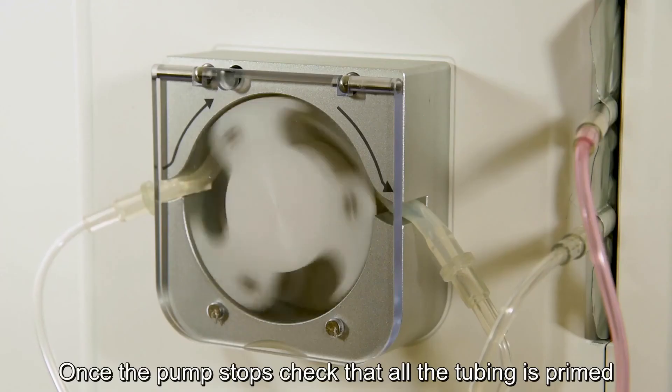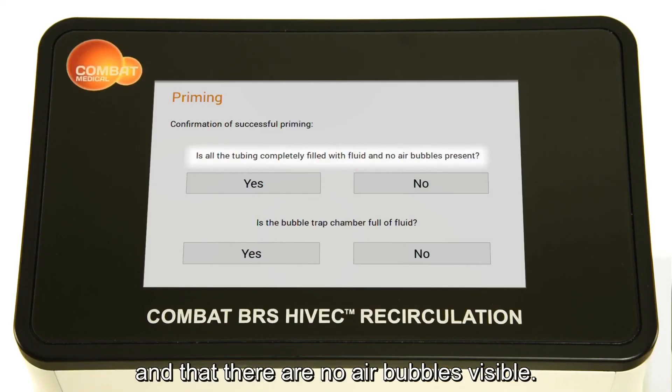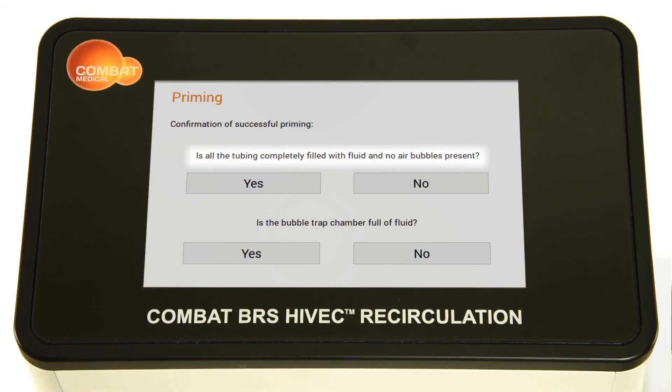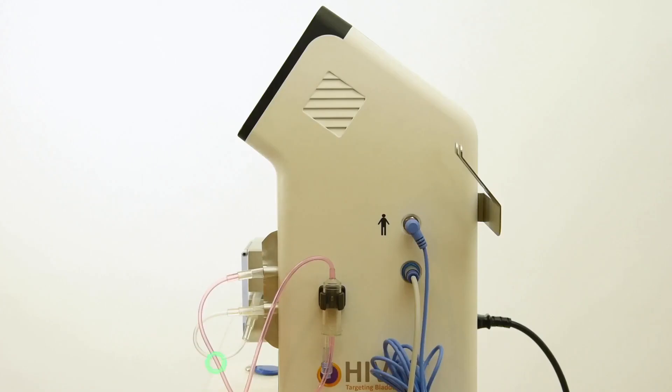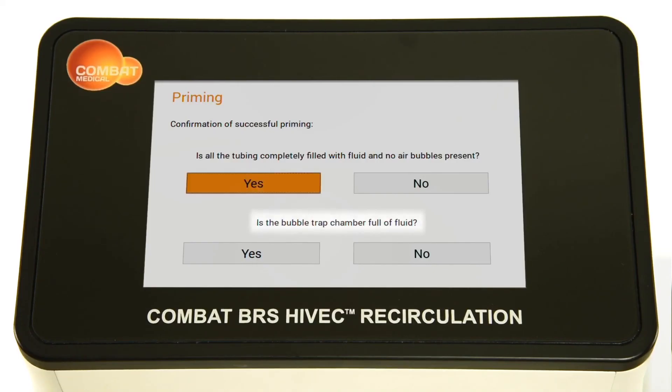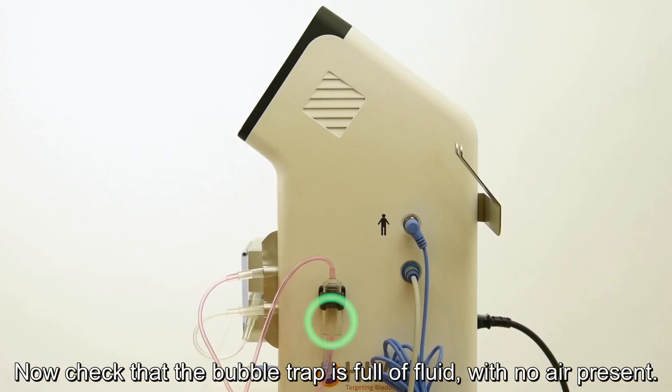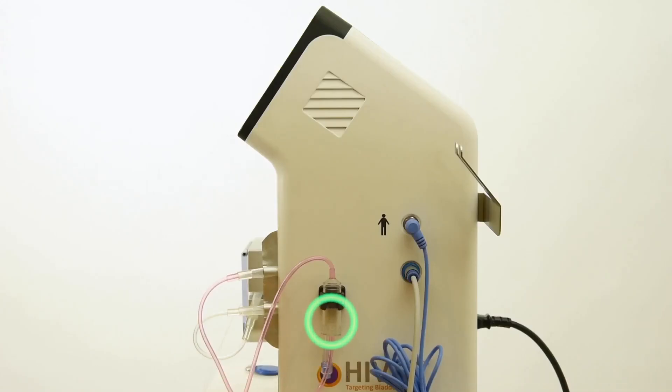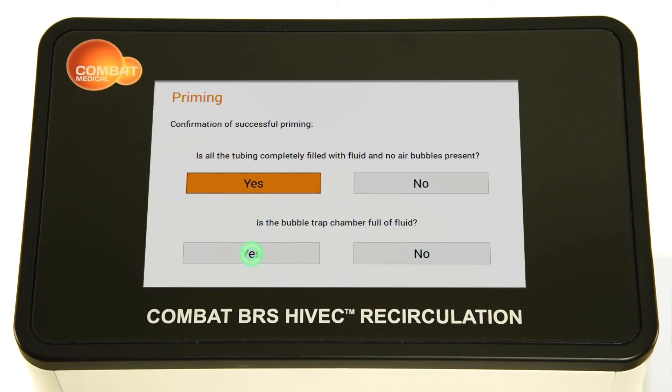Once the pump stops, check that all the tubing is primed and that there are no air bubbles visible. And confirm. Now check that the bubble trap is full of fluid with no air present. And confirm.